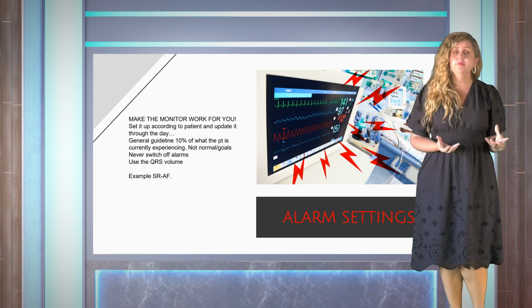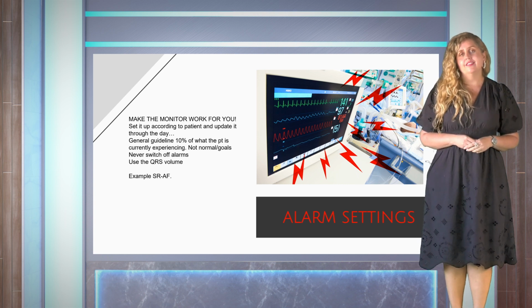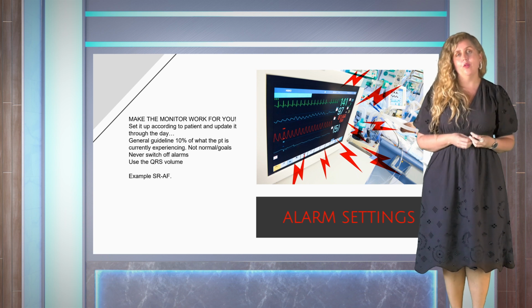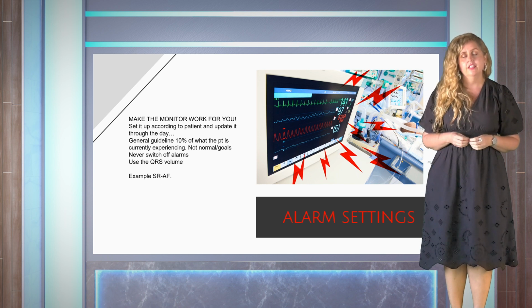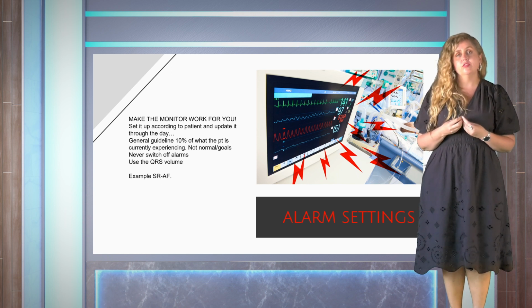Maybe the most important part about hemodynamic monitoring is setting the alarms. I've had the privilege of being in touch with a mentor, an ICU guru, who once said that the monitor should be seen as the little robot or the slave for the ICU nurse, and we need to program it to work for us throughout the whole day. It's your little helper. The idea is not to program alarm settings that are just the normals of each factor. You need to program it according to your patient.